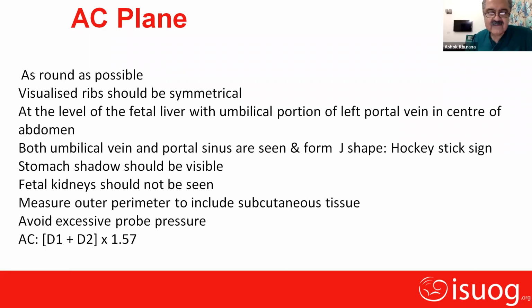Suresh used to tell us about the rice grain-like appearance. I remember that. There you can see the adrenals lying down, looking like rice grain. Kidneys are absent. So C is the correct answer, madam. And there is a significant improvement in this question also, from 56% during the pre-orientation poll questionnaire to 94%. Great. But it's also encouraging that 56% knew that kidneys and bladder should not be measured.